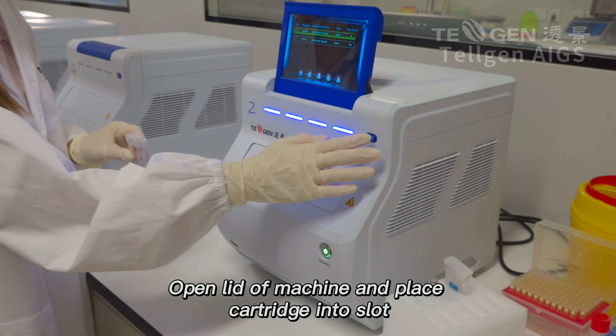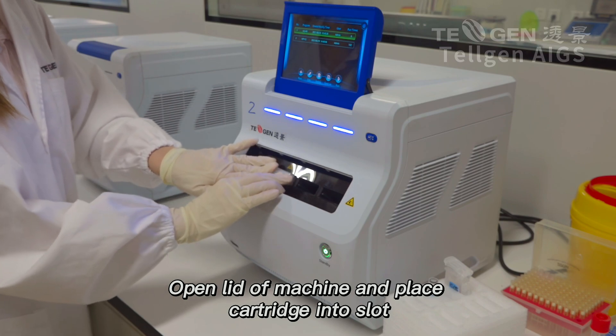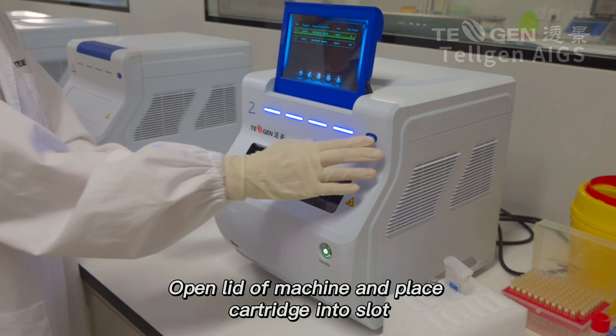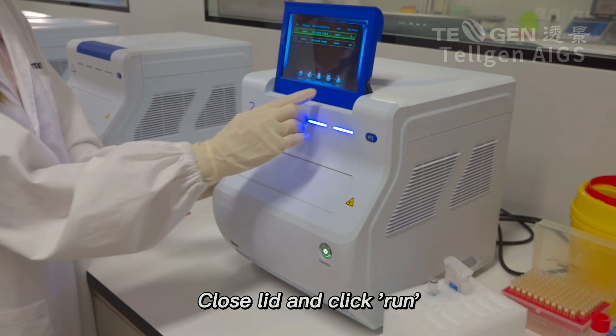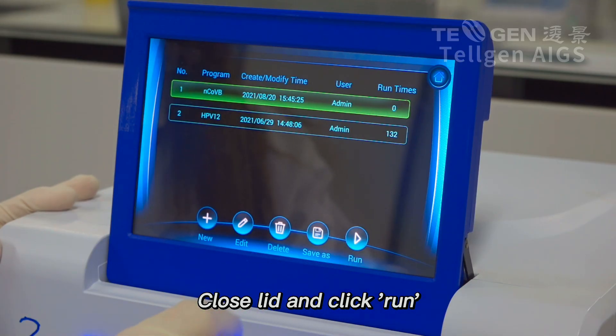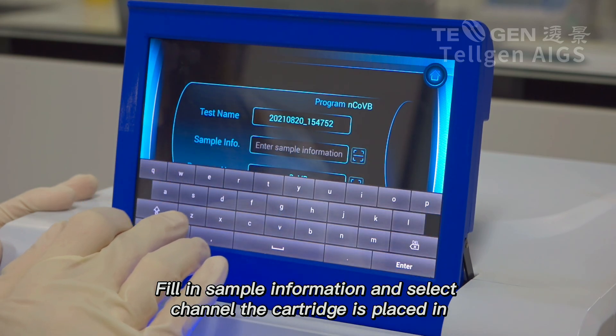Open lid of machine and place cartridge into slot. Close lid and click Run. Fill in sample information and select the channel the cartridge is placed in.